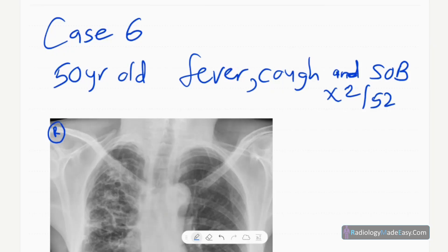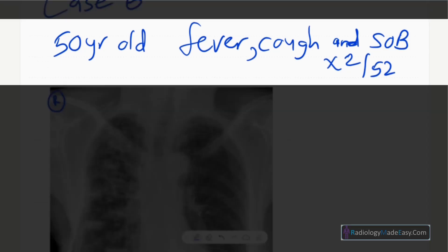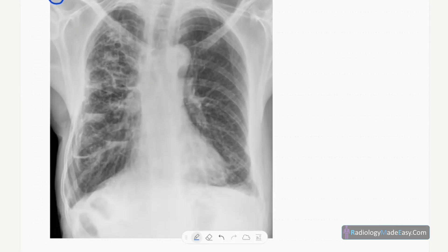Welcome back everyone. This is case number six of our series in radiology. Our patient today is a 50-year-old man who presented with fever, productive cough, and shortness of breath for two weeks duration. This is the frontal chest radiograph of this middle-aged male patient.